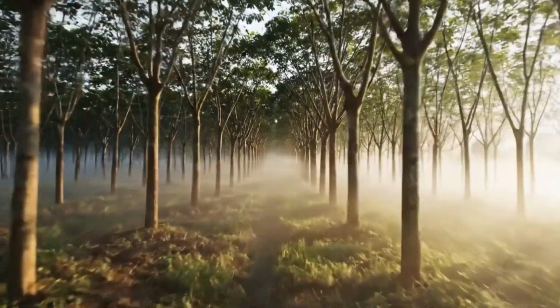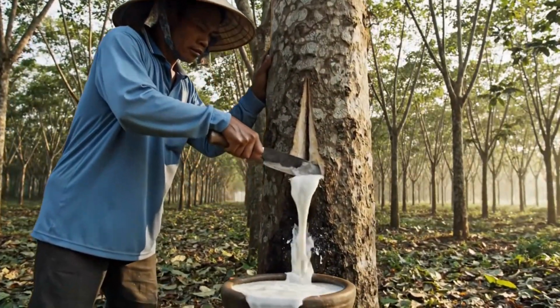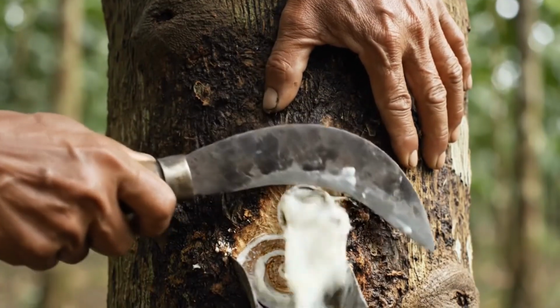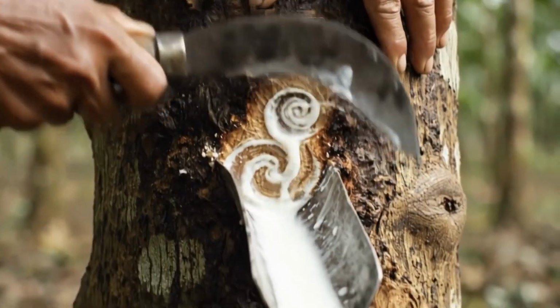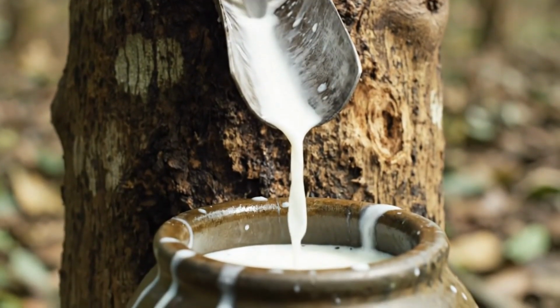The journey of a high-quality condom doesn't start in a lab, but in the heart of nature, within the sap of the rubber tree. Tapping is an art. The cut must be deep enough to release the latex, but shallow enough to keep the tree healthy.